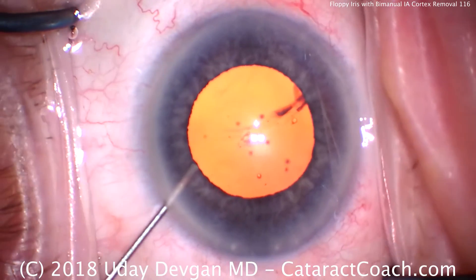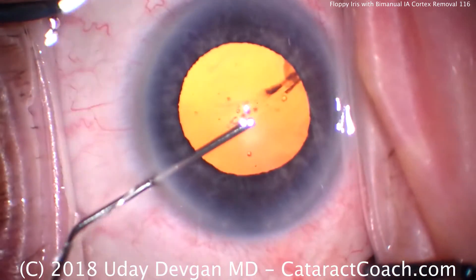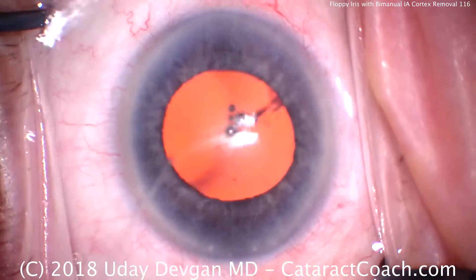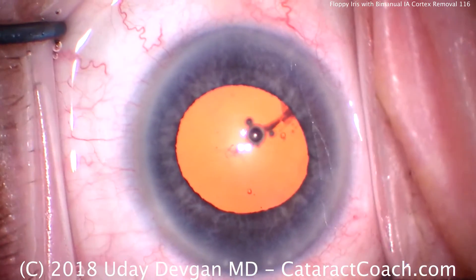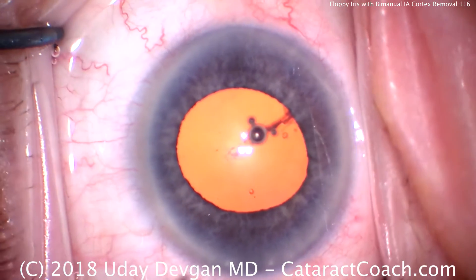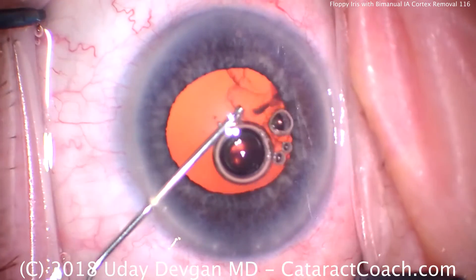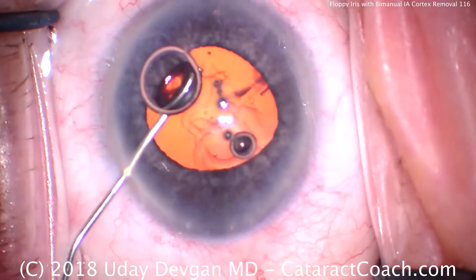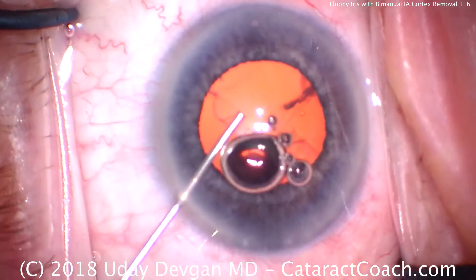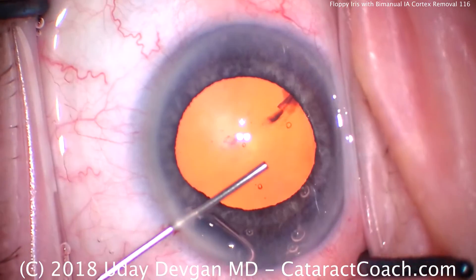The technique I want to teach today is bimanual cortex removal — bimanual irrigation aspiration. We're going to use a transformer IA handpiece that splits apart so I can have the infusion in one hand and the aspiration in the other. That's going to allow us to get under the edge of the iris, under the rhexis, and really clean up and get out that cortex. That's the neat technique of the day.